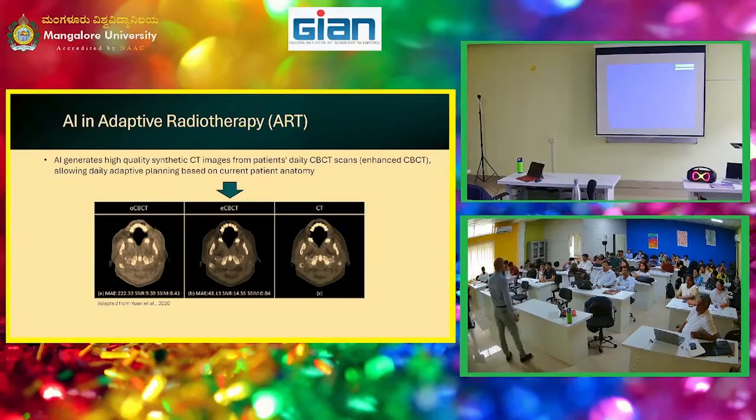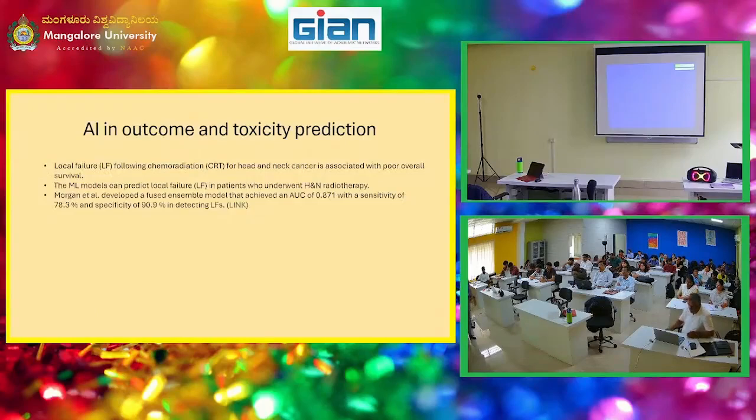So that's very helpful, right, for planning. Then you'll have reality, because you'll actually have to take a CT at some point. But you could also, through generative AI, actually predict what it will look like, which is very helpful for planning, especially for this one, right? So if you have a trajectory of a patient that shows that they're going to react more poorly to treatment, then you can help with this. So not only adapting what the next treatment's going to look like, but in this case, maybe even changing the plan once you see, to accommodate the patient. Yeah?